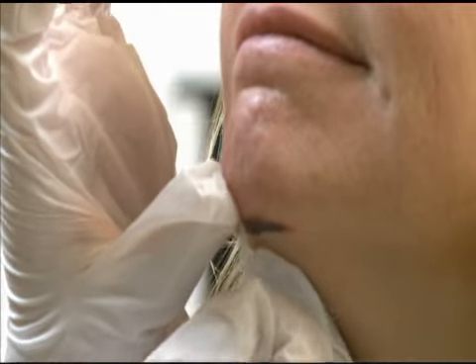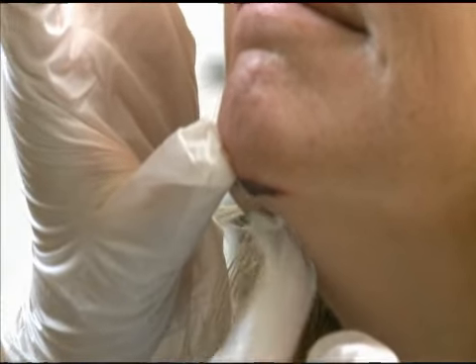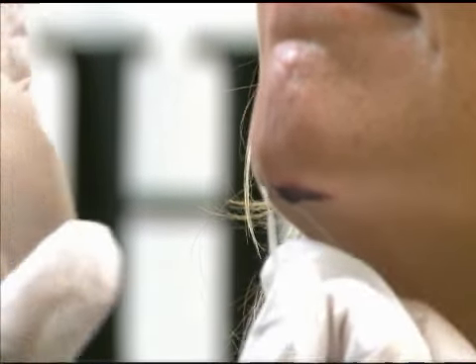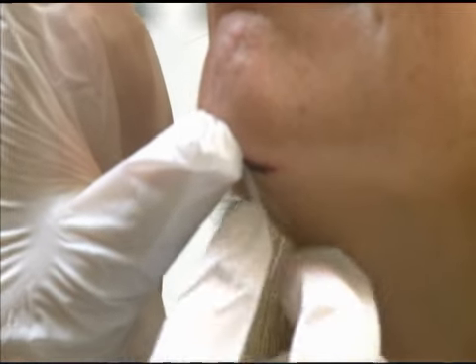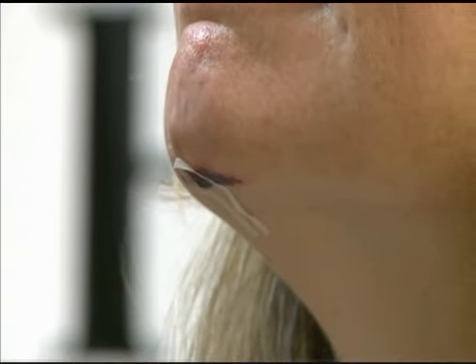Apply a Steri-strip on one side and pull the wound together. Start each strip on the same side. Begin where the gap is widest, then the next largest gap, and so on until the gap is closed.